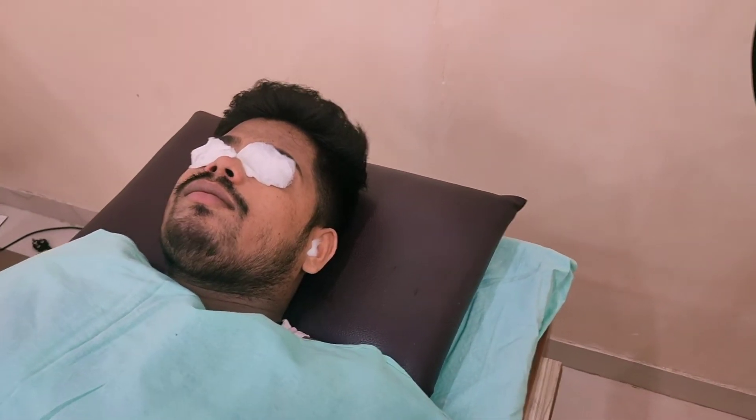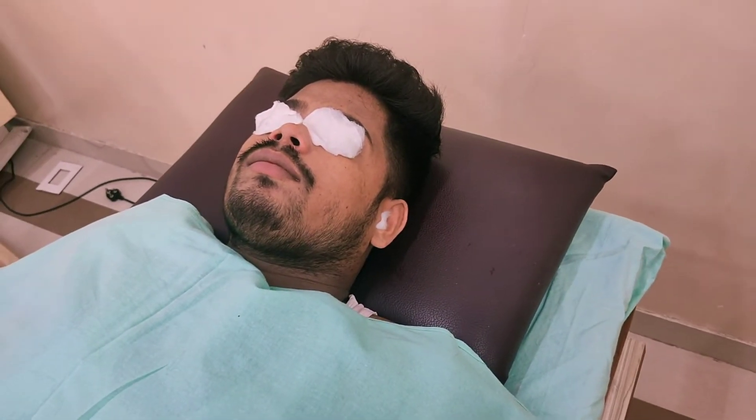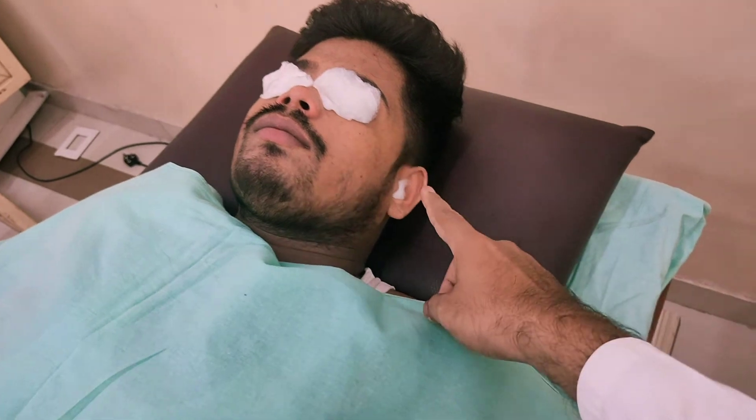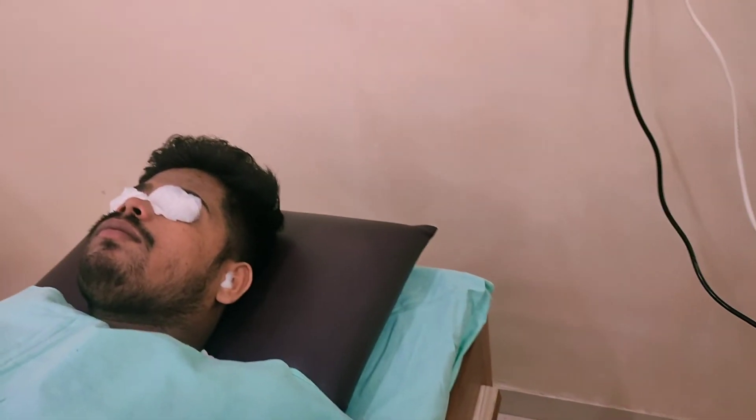First IR for the face. I am here applying it on the left side of the face. To protect the eyes, I applied wet cotton on both eyes. Draping has been done of the whole body properly. The only part which has to be exposed is wherever you are doing the application.